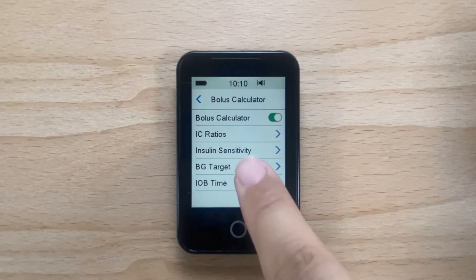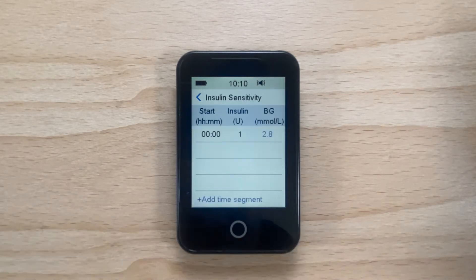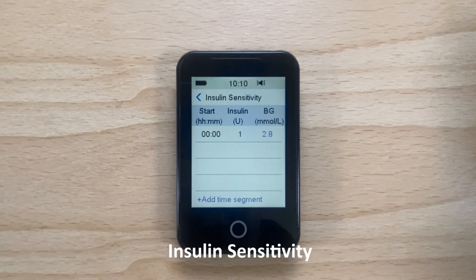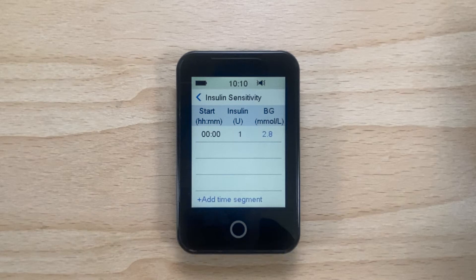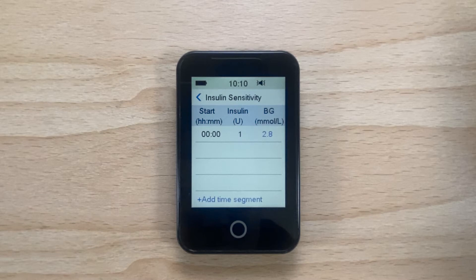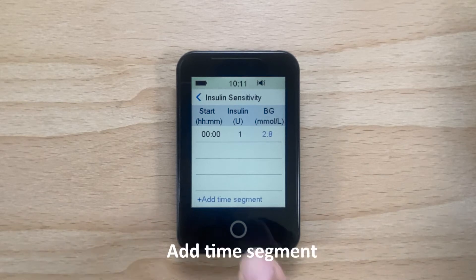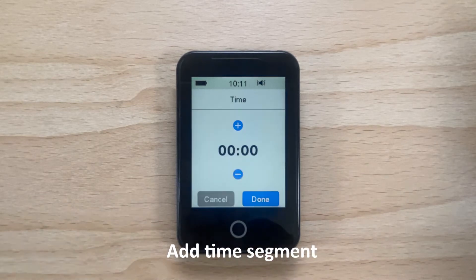Now you can set up your insulin sensitivity for your pump by tapping on Insulin Sensitivity. You can add up to 8 different time segments for the day depending on your need for different insulin sensitivity at different times. Tap Add Time Segment to add a new time segment.